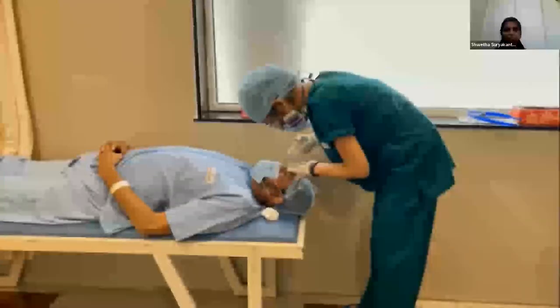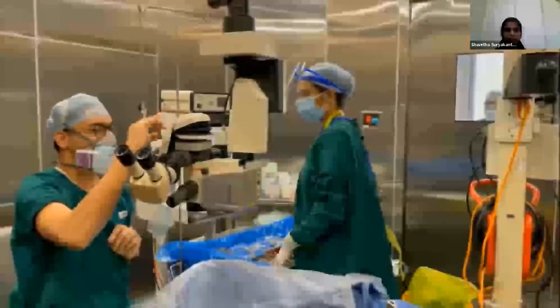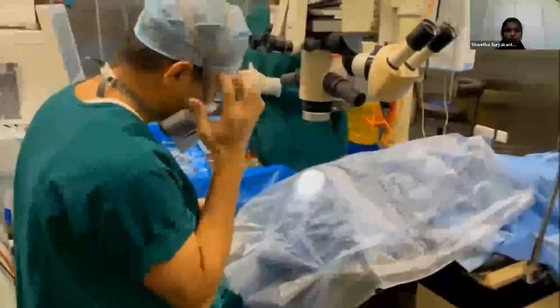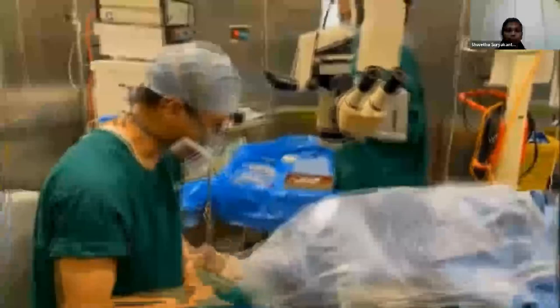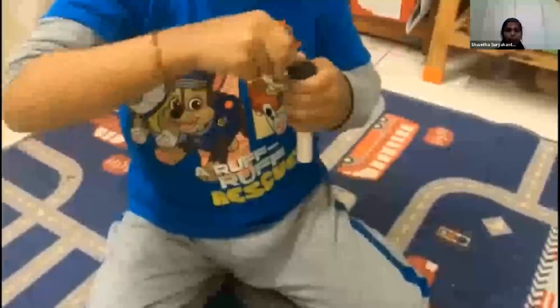The patient was shifted and was given a peribulbar block. After block in OT, intraocular magnet is not available. So, what next? A little flashback into the childhood gave us an idea. As kids, we would have played with magnets and experimented with them. Temporarily transferring the magnetic property to non-magnetic metallic objects would have been a child's game back then. We thought if we can use this property in our case today.